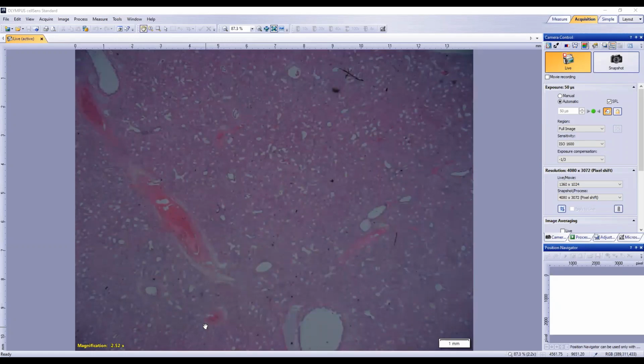Then we go see whether there is infiltration of any inflammatory cells, particularly within the alveolar septa, and what comes associated with this. Also moving forward, we would look after that to the lymphatics.